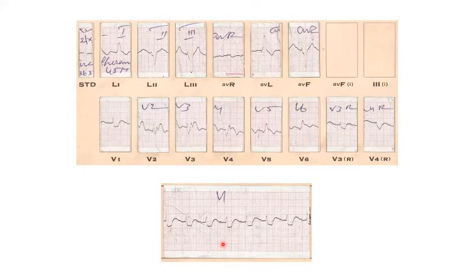It is the same. So this is a 2:1? Yes, sir. 2:1 block. So what is the full diagnosis? Sir, this is 2:1 AV block. QRS taking left bundle branch block morphology. Why do you want to say that QRS taking left bundle branch block? Left bundle branch block. Don't use the word QRS taking a left bundle branch block morphology. Do you have any other diagnosis for that morphology? No, sir.